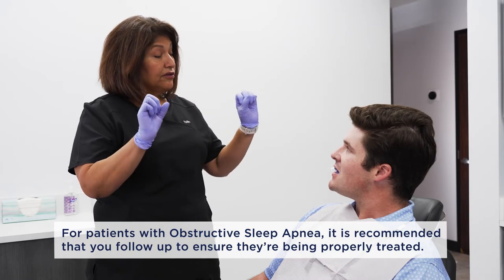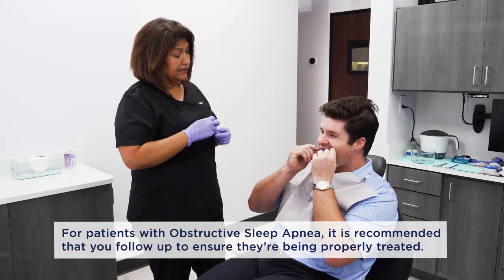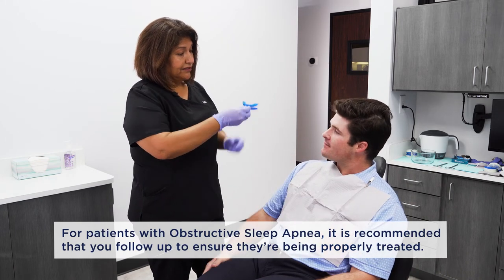Now to remove it, you're going to take your thumbs, just lift — the bottom one off, and then the top down, and there you go. And you're set.